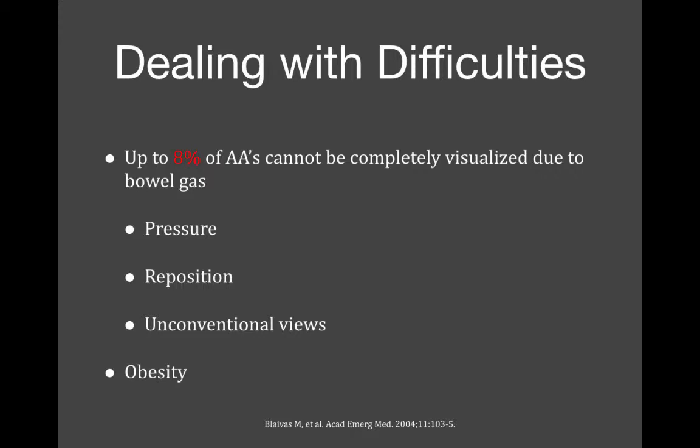You can also come down in a parasagittal plane, probably about the mid-clavicular line, and try to image down to the aorta in that method. We can work on these in our scanning stations, but there are other ways of trying to find that abdominal aorta and assess for at least segmental views to evaluate for aneurysm or not.